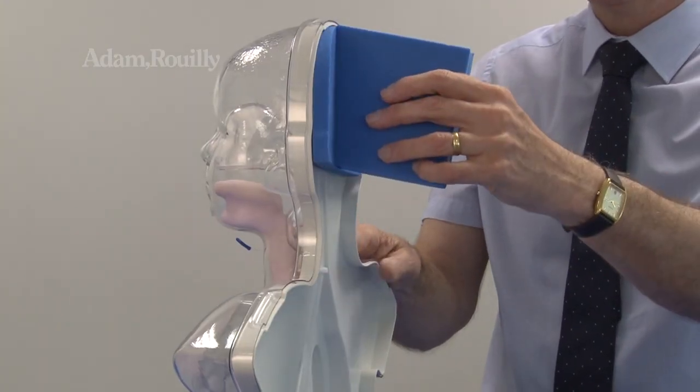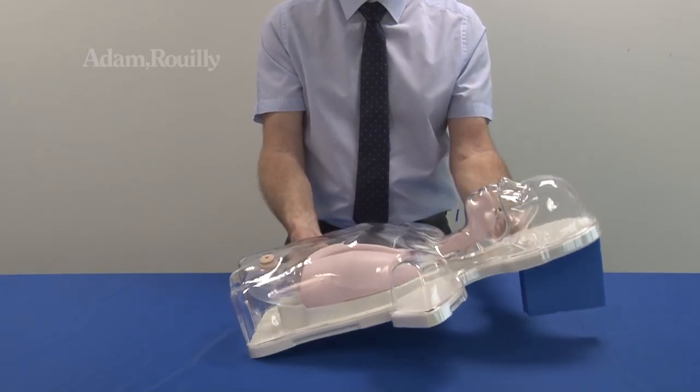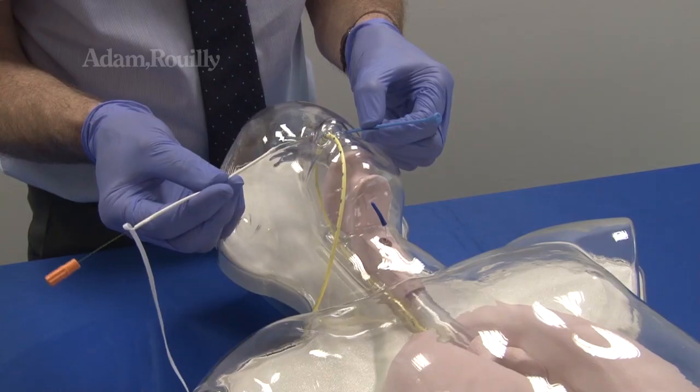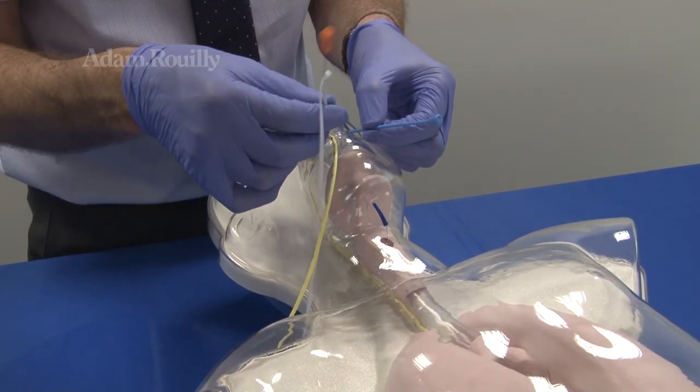To use the model in the supine position, insert the foam head support into the back of the model as shown. A nasal bridle can be used via the divided septum.